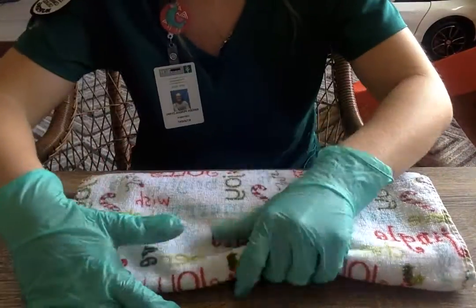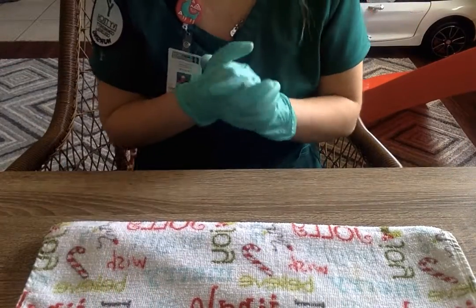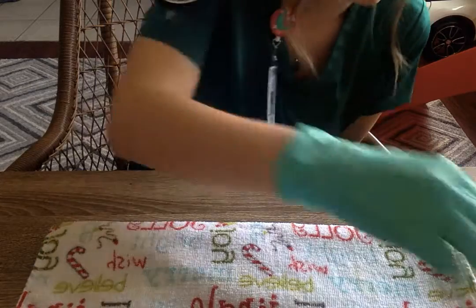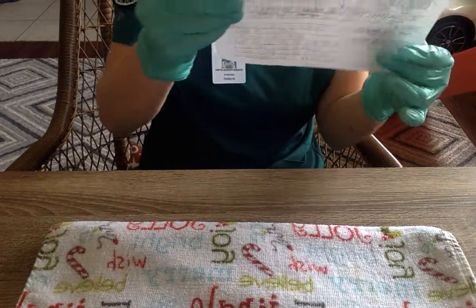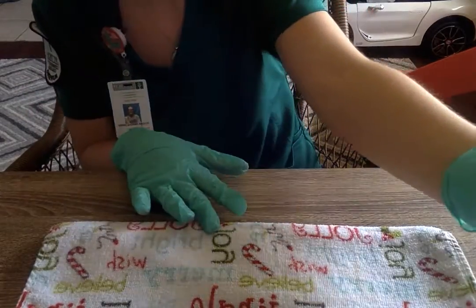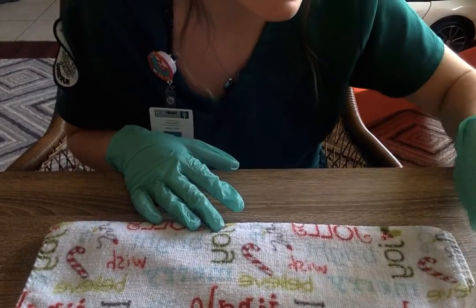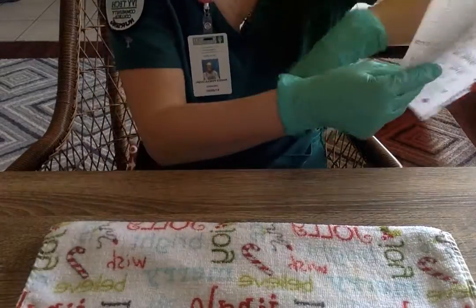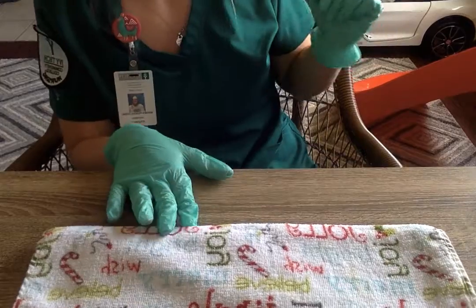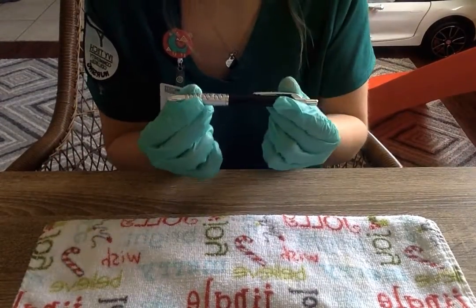Now next I'm going to be moving on to my intramuscular, and that is going to be my, I'm sorry, it's so hard for me to say, meperidine hydrochloride, which is Demerol. And that is my intramuscular injection. And like I said, that is going to be the 18 to 27 gauge with the 1 to 3 milliliter syringe. So I have everything ready right here.